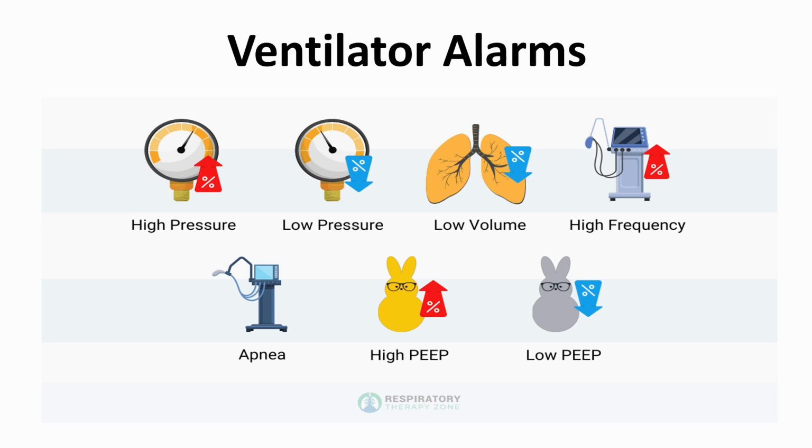We have different alarms, which are high pressure alarm, high peak pressure alarm, which is around 30 to 40 centimeter water according to setting to the patient. We commonly use 30 as our limit. And recently some devices have something named sustained ventilator pressure alarm, which is saying that you haven't responded to the high alarm for a period of time.